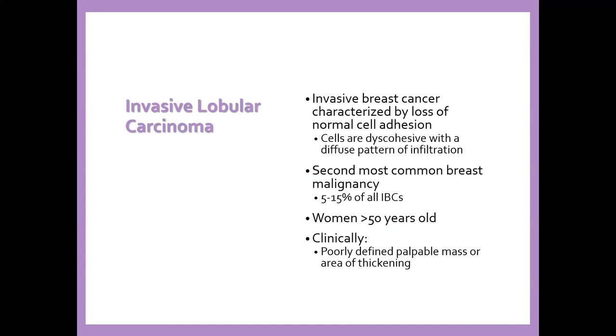Invasive breast cancer, lobular carcinoma, is characterized by loss of normal cell adhesion. Cells are discohesive with a diffuse pattern of infiltration. This is the second most common breast malignancy. 5 to 15% of all infiltrating breast carcinomas are infiltrating lobular carcinoma. They occur in women more than 50 years of age. And clinically, they have a poorly defined palpable mass or areas of thickening.